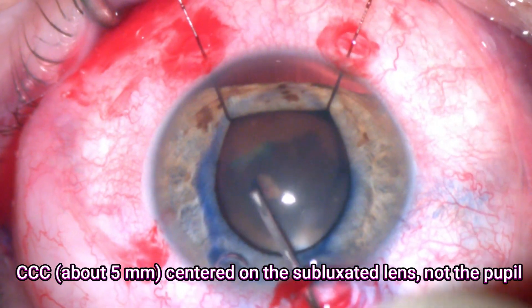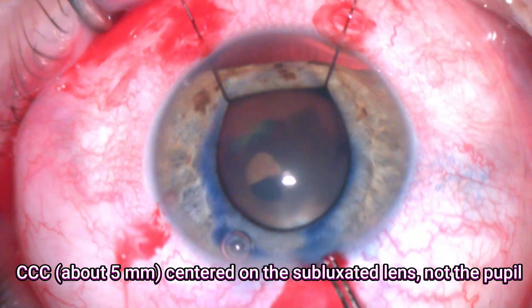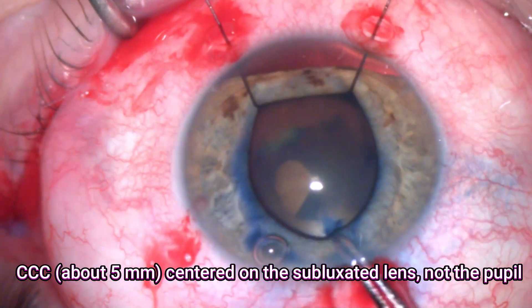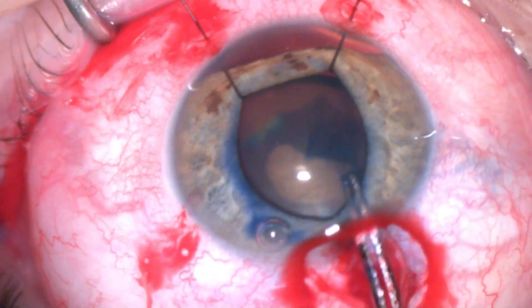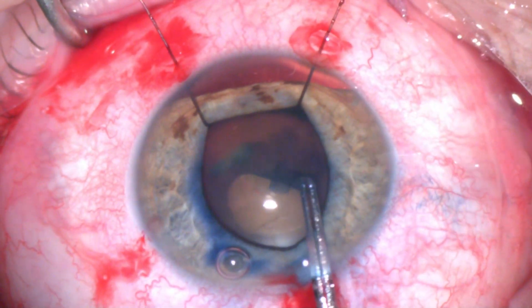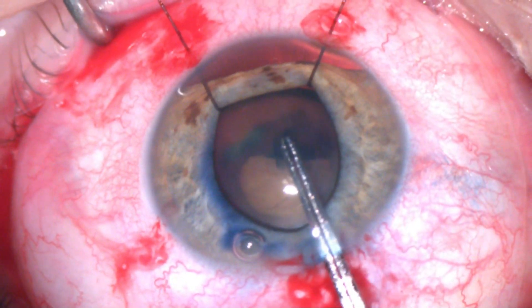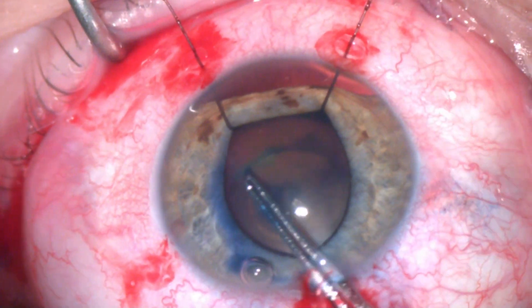I started the capsulorhexis. The main aim here is to create about a five millimeter capsulorhexis. It's really important to be centered about the lens, not the pupil. Just keep in mind that the lens is slightly de-centered, so we'll try to center this capsulorhexis around the area of the lens.